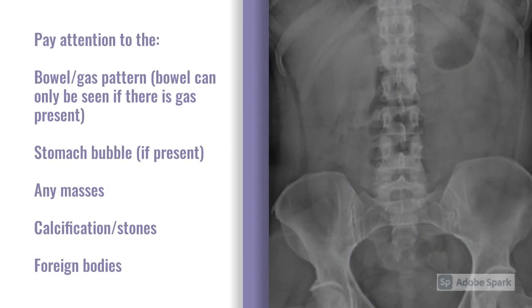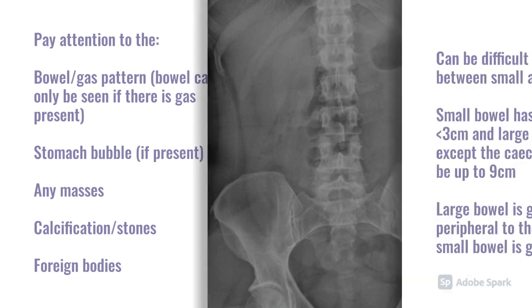When looking at an abdominal x-ray, there are a couple of things to pay attention to. The image shows a normal abdominal x-ray. You're going to look at the bowel and the gas pattern in particular, bearing in mind that you can only see bowel if there is gas present in it. Note a stomach bubble — that can often be difficult to interpret and might appear to be large bowel. Look for any obvious masses, check for calcification of arteries or other vessels, check for kidney stones, ureteric stones, and bladder stones, and make sure you look for foreign bodies as well.